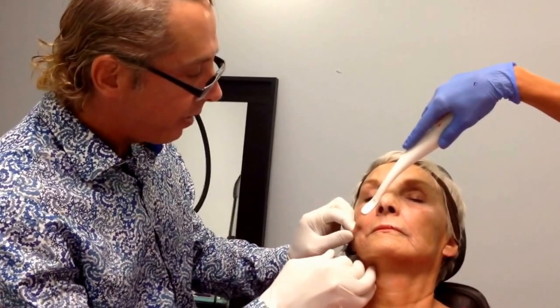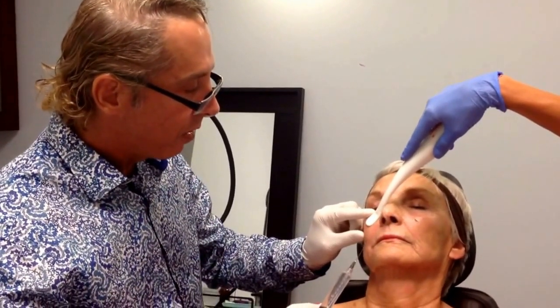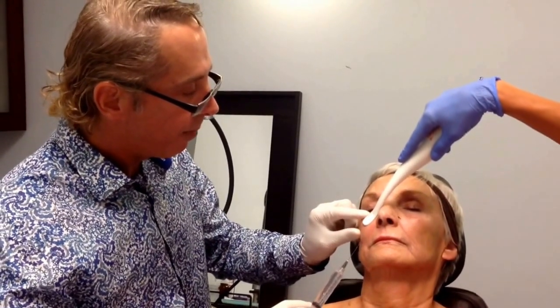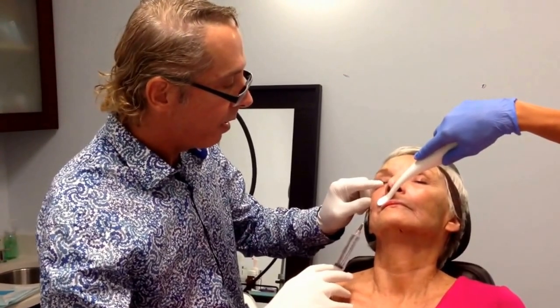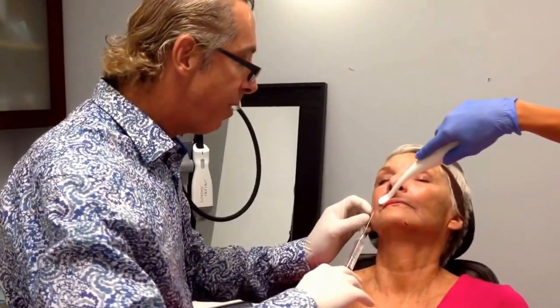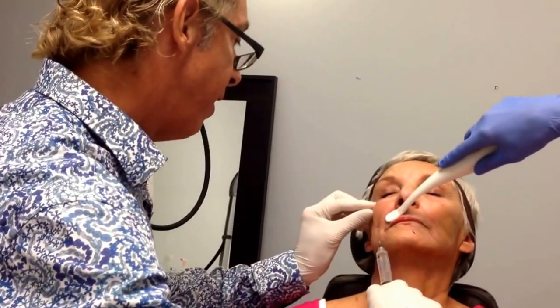What I'm using is lidocaine 1% with epi. Chin out for me. And I'm blocking down here. Now I come over here — I block the zygomatico-temporal, which is right here.